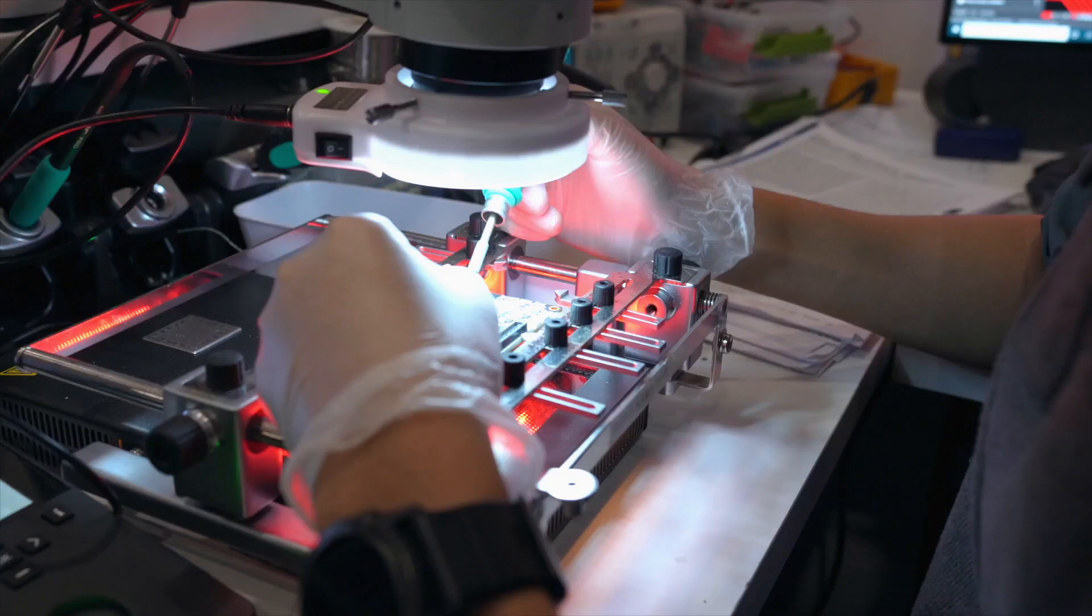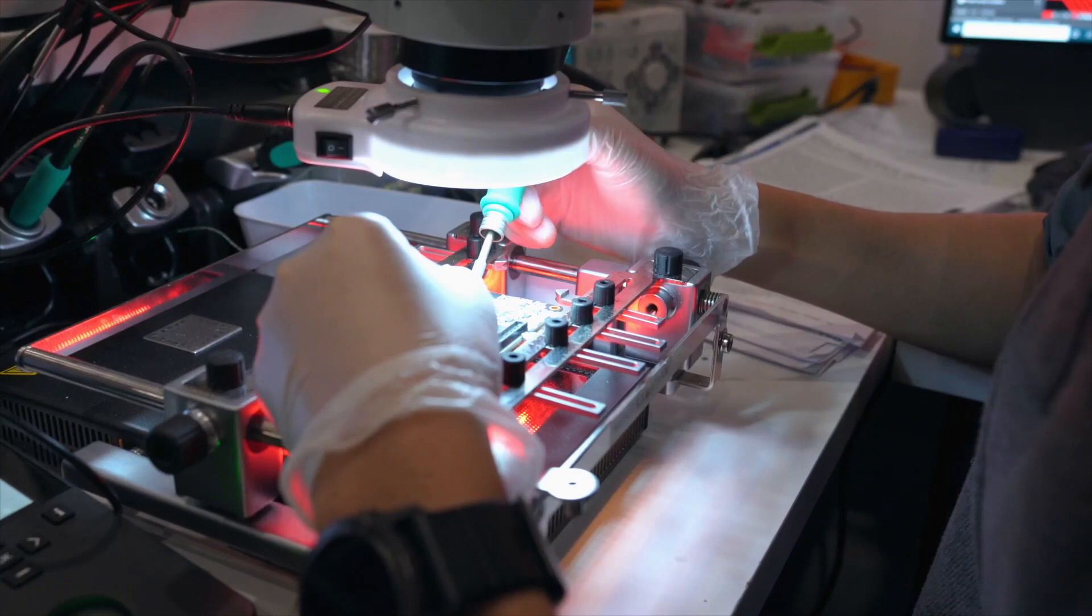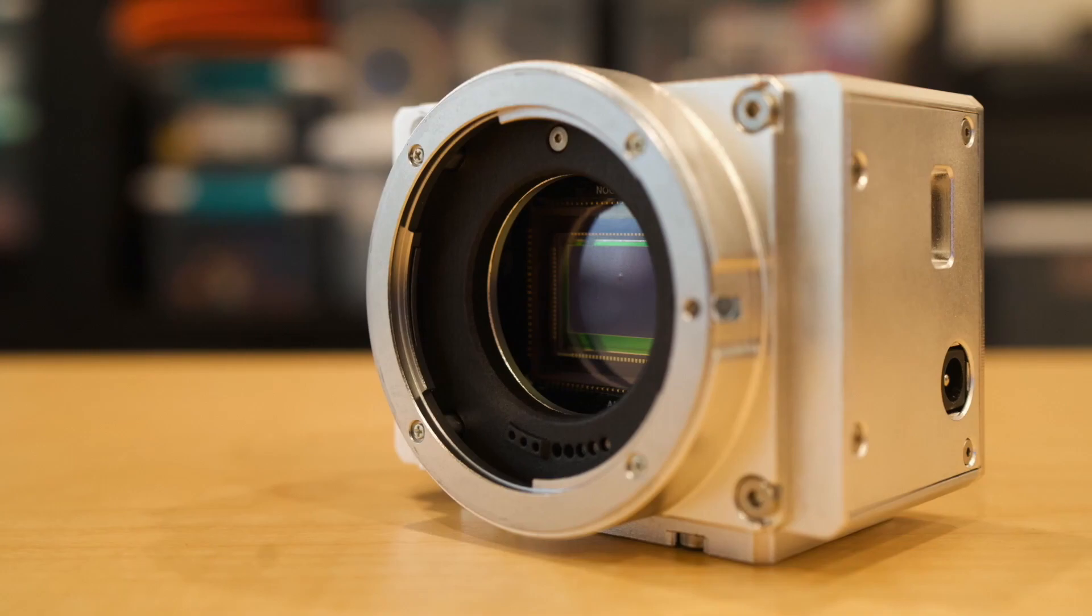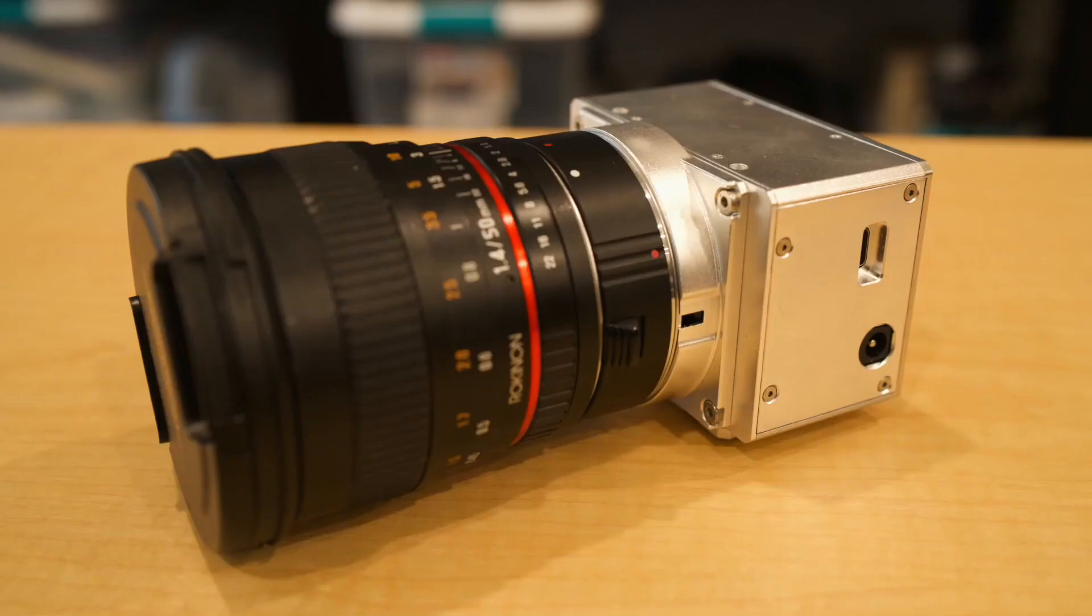So, we integrated image sensors that mimic the mantis shrimp's compound eye, and optical filters that can separate the visible from the invisible, and we built a camera sensitive to six colors of light spanning the visible and near-infrared.